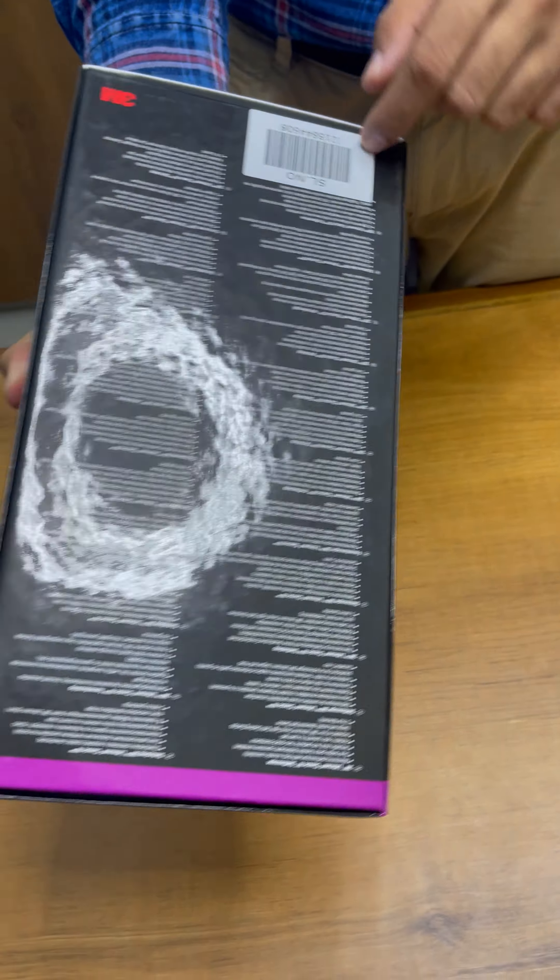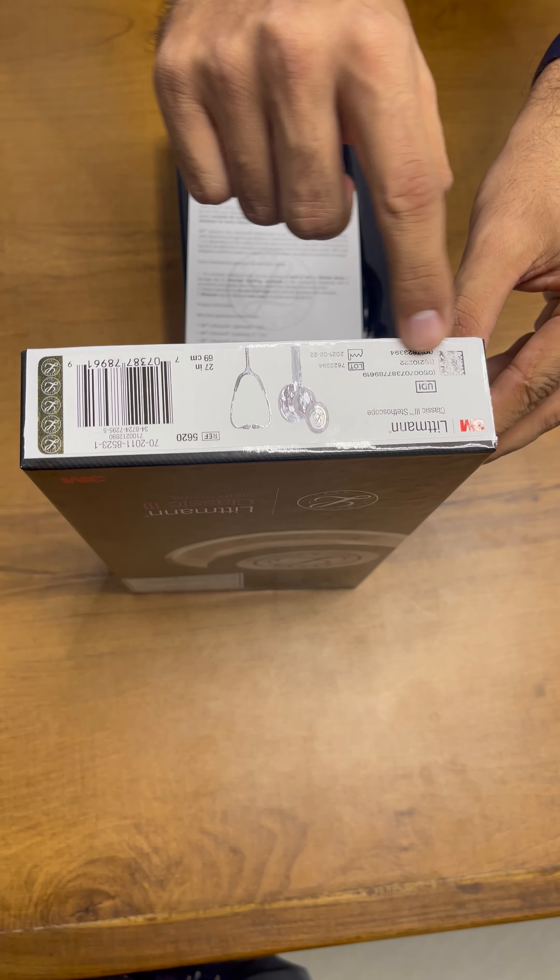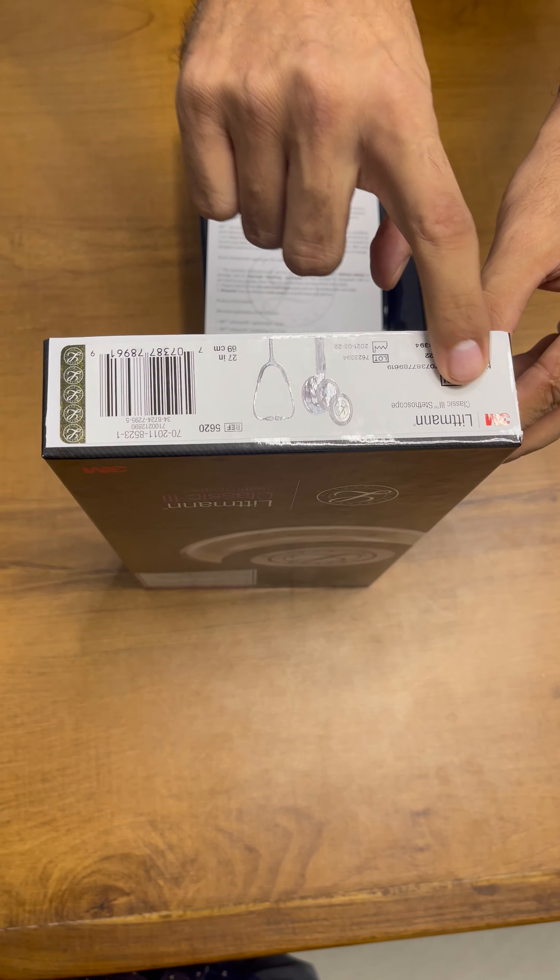You can see the serial number provided here. We are just going to open the device. You can see the MRP here, and you can see the model number here which is 5620 — the Littmann Classic 3 stethoscope.